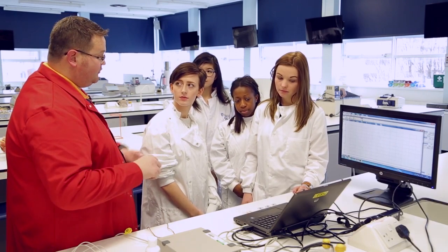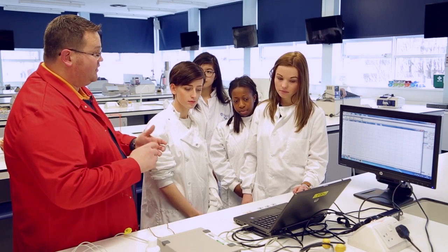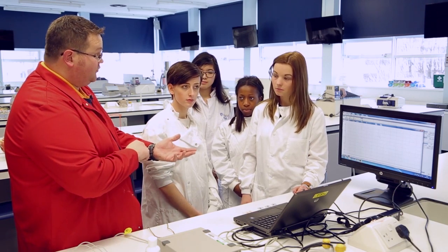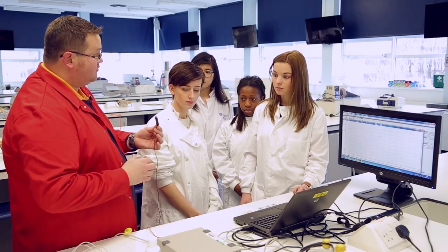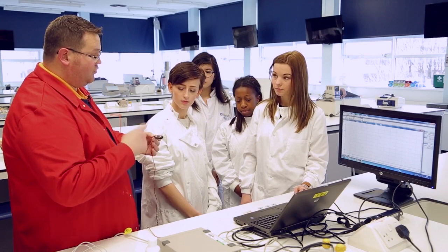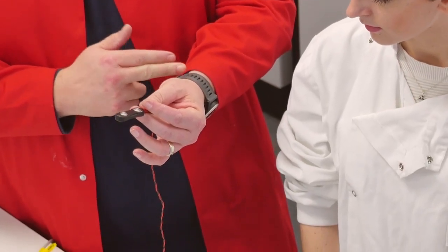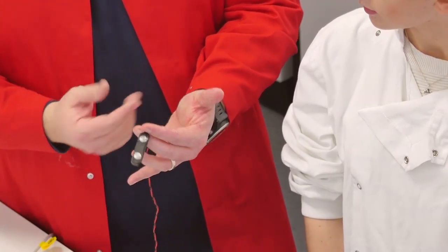We're doing the nerve-muscle stimulation demonstration where we're going to be stimulating the median nerve so that you can stimulate and get a muscle contraction. We've got a stimulating bar that will pass a small current of electricity through it, which will penetrate down into the motor neuron, and if we can hit the motor neurons of the median nerve you should get that muscle contraction.